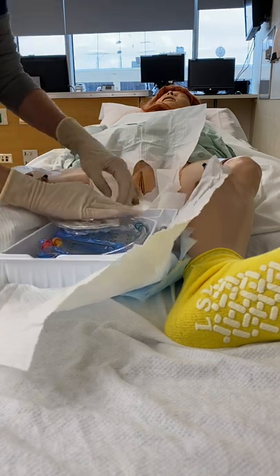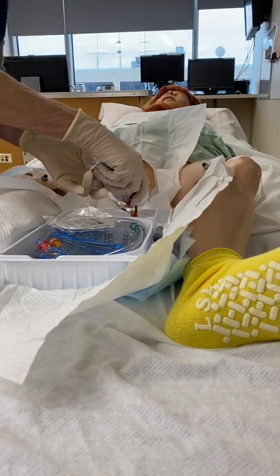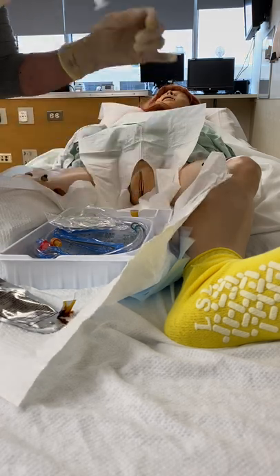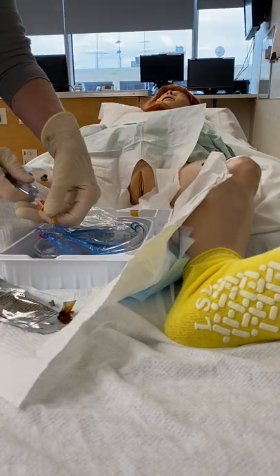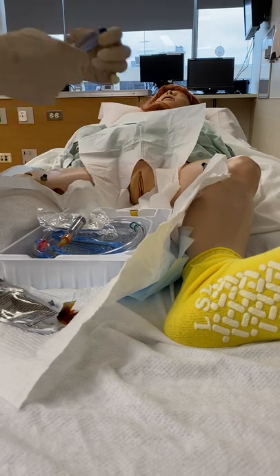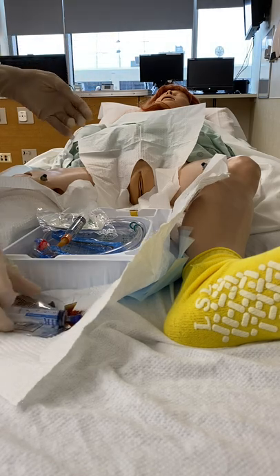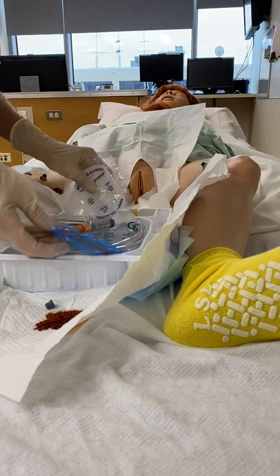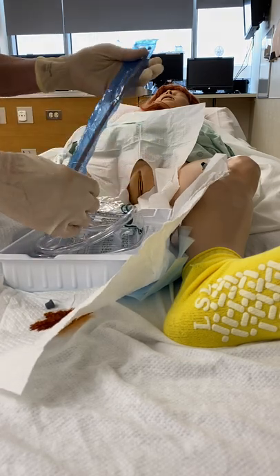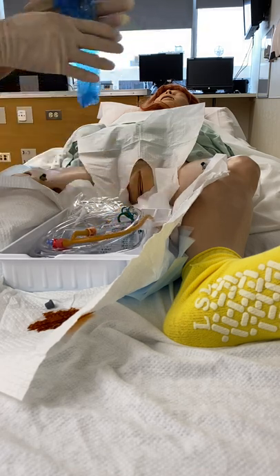The tray tells you exactly what to do — there are numbered steps. Number one: open and pour the iodine. Number two is next. Number three: attach the water syringe to the port. Number four: dispense the lube — open it and squeeze it right into there. These items can go into the garbage. Then carefully slide the blue cover off the Foley tip and place the tip right in the lubrication. Throw that cover out.